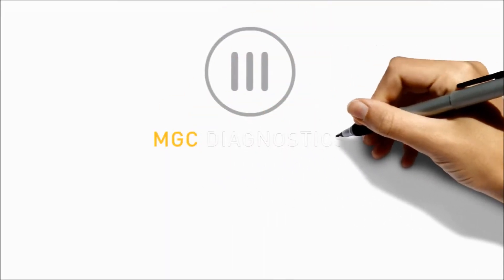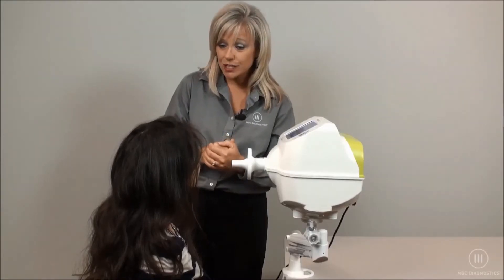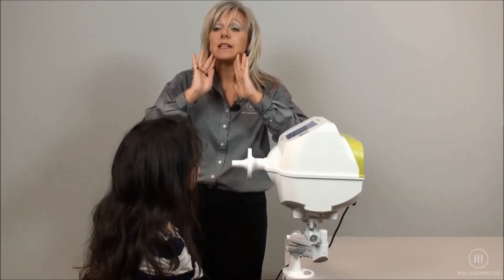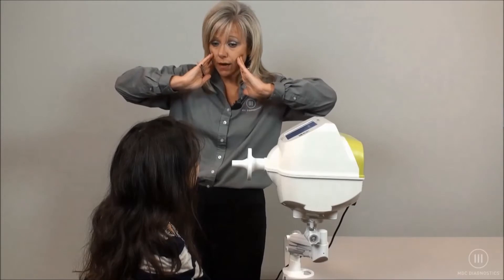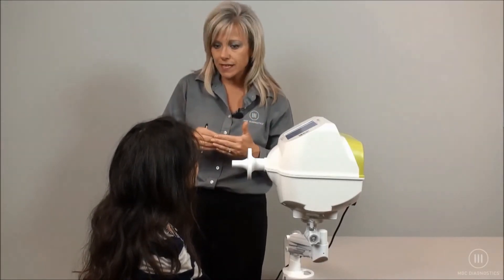Welcome to the MGC Diagnostics Resmond Pro FOT training video. You're going to put your mouth on the mouthpiece with a tight seal, with your neck slightly flexed, nose clip on, hands on your cheeks, and your elbows out. You're simply just going to breathe normally for approximately 15 breaths.